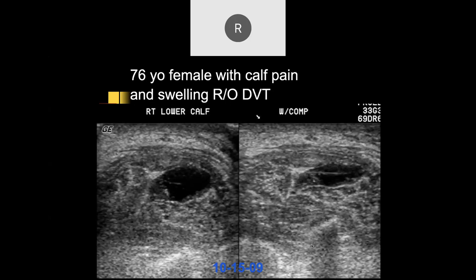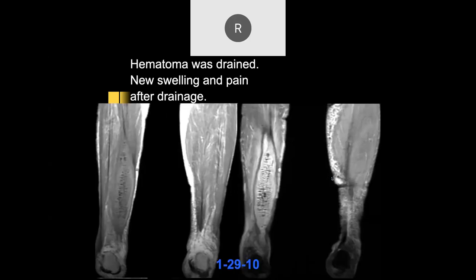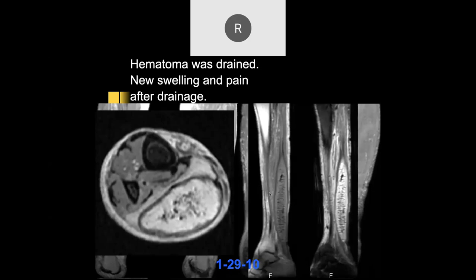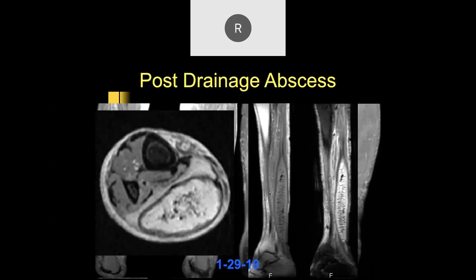A 76-year-old with calf pain and swelling, rule out DVT. On ultrasound, there's a compressible fluid collection with maybe some septation and no vascular flow — possibly a hematoma or cyst. They thought it was a hematoma and put in drainage — we can see that mirror artifact in the drainage area. On subsequent MRI, this turned out to be a post-drainage abscess: they drained it but then the drainage got infected, probably not infected on the initial ultrasound.